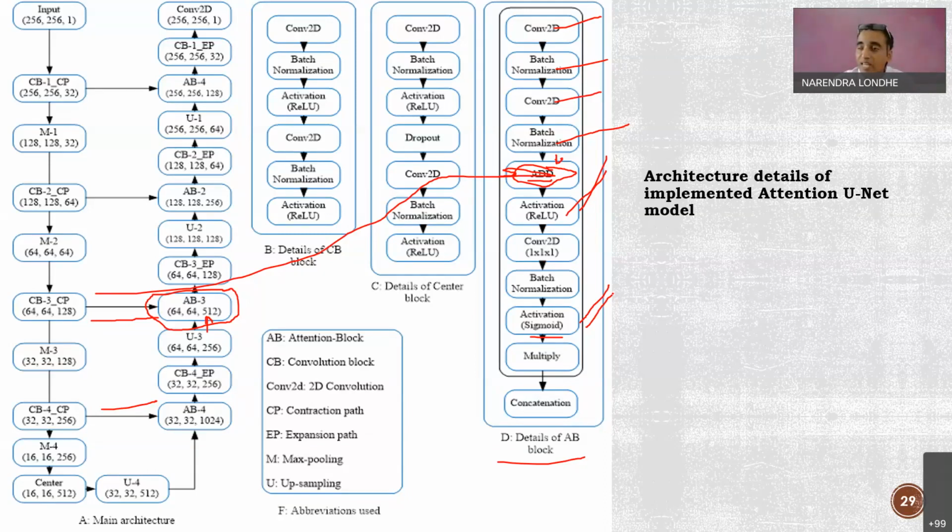What it does is it takes all the values and gives you probability values, two probability values. It will give the probability that it is either this one or that, based on all the values given to it. So one probability value will be maybe higher for, say, malignant, and lower for the benign. That is how it is used. Okay, got it, sir. Thank you, sir.